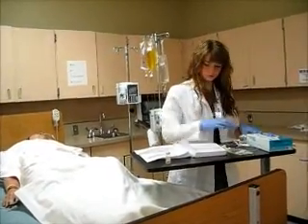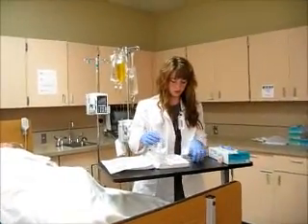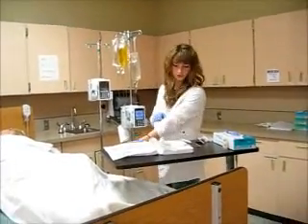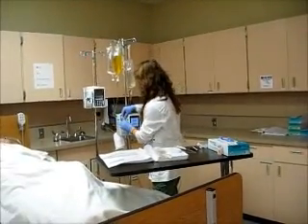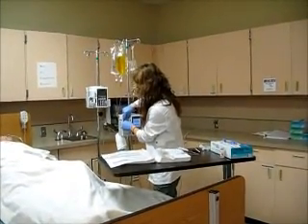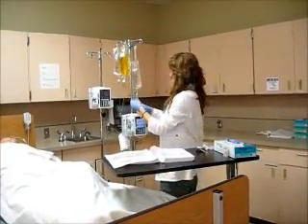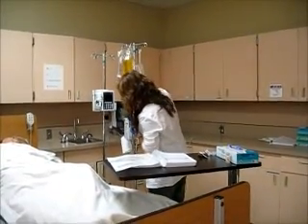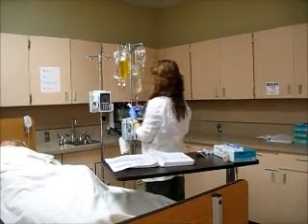So now I can go over to my infusion, and we're going to pretend that there's a cap on here. There's not, but we're going to pretend. I'm going to be putting the insulin into this port here so that I can run it concurrent with the fluids that I have. So I'll alcohol swab this off for 15 seconds. Alright, and now I'll take the cap off of this and put it right on there. I'll unclamp my tubing.